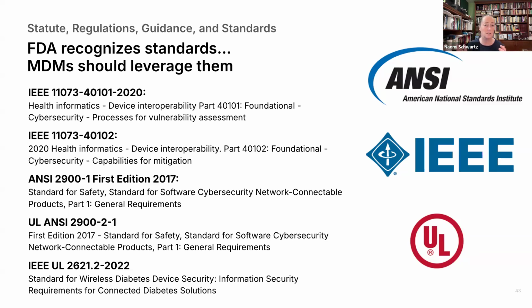Unfortunately, FDA currently does not consider them a standards defining organization, so they don't recognize the Bluetooth SIG work products, even though they are based on recognized standards like 11073. That is a thing that I've been trying to talk to them about for a while, and I think it should be eventually adjusted with enough pressure from industry, but keep in mind that the Bluetooth SIG products really do follow the standards. So if you're using a Bluetooth SIG product and it correlates to a standard, cite the standard.